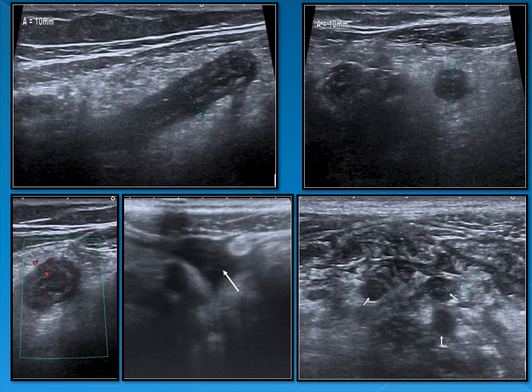Another example showing the longitudinal section of the appendix with a thickened hypoechoic wall, also seen in transverse image. Hypervascularity within the wall, fluid, and lymph nodes are noted. The surrounding fat within the mesentery is heterogeneous and hyperechoic.